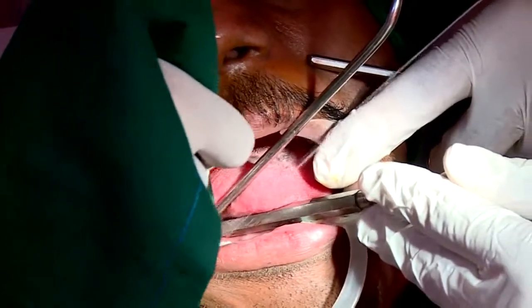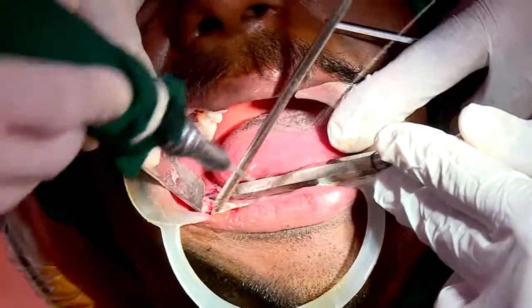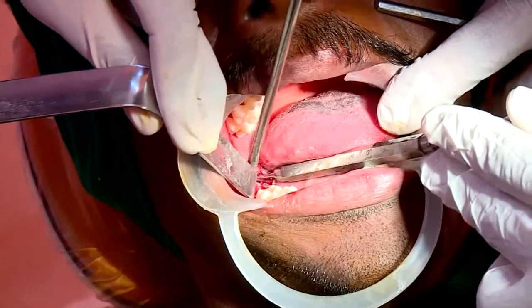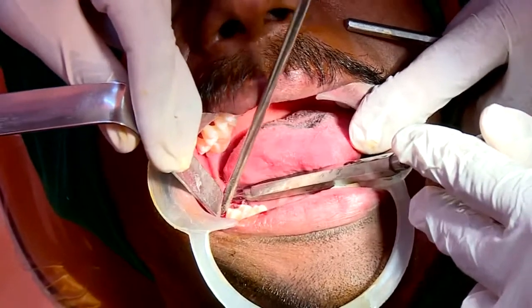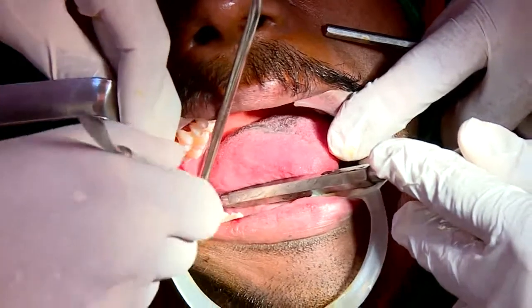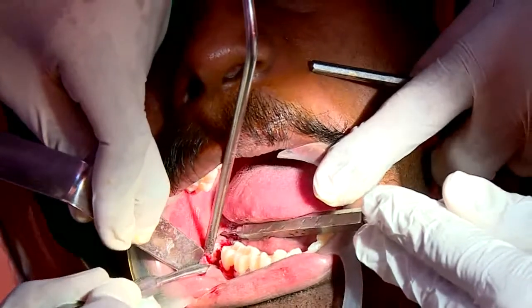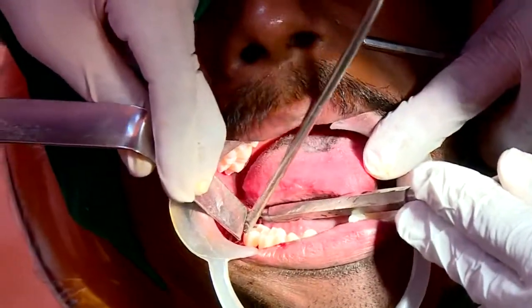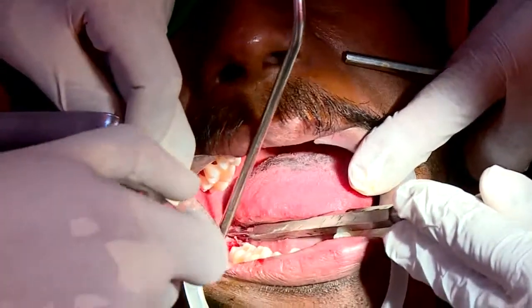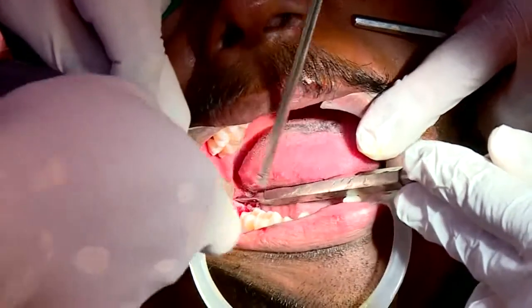Suction is very important. In your assessment, you will always give good suctioning. Under-suctioning makes it very hard to see inside. There will always be a little amount of blood that keeps coming, so initially you have to tell your assistant to be very efficient, to suction as much as possible and give us good visibility.